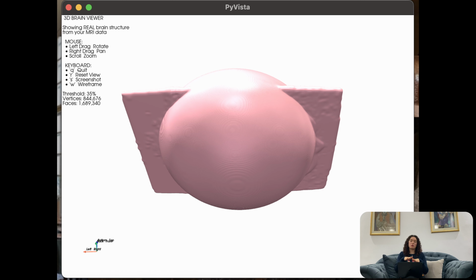It brought in the 2D MRI slice. It detected the edges, the contrast, the difference in intensity, frequency, and stuff like that. And those detected lines, it brought out into a kind of wall shape. So it really detected some stuff, but it just extruded them to make a 3D.